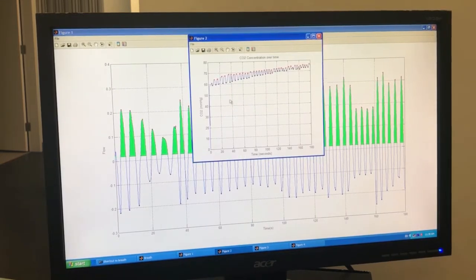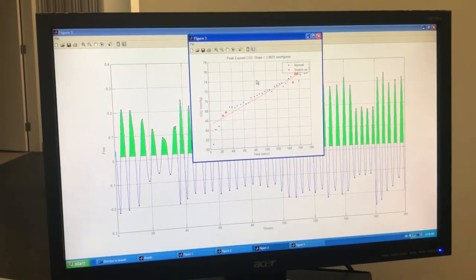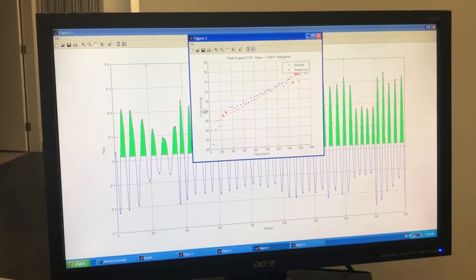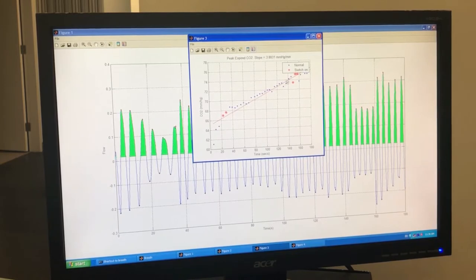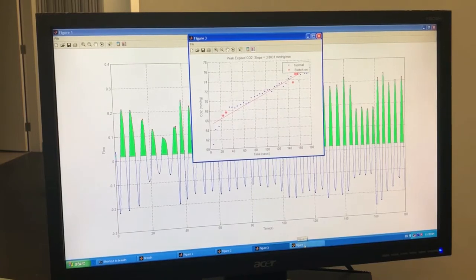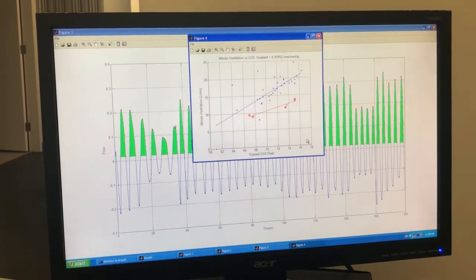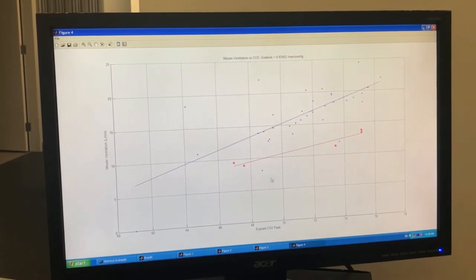They usually skip figure two and go straight to figure three, which shows time versus CO2 concentration. This shows the rate of CO2 production in the body — the amount of CO2 metabolism is generating just by sitting there. They almost always show this graph and point out the restriction breaths here and here, then bring up the final graph for the main take-home message.